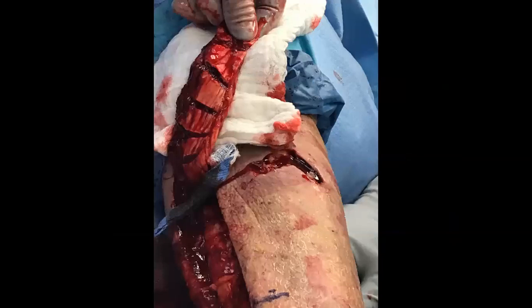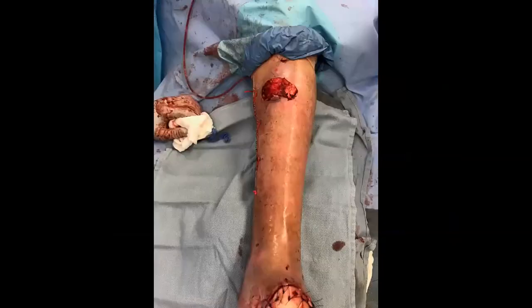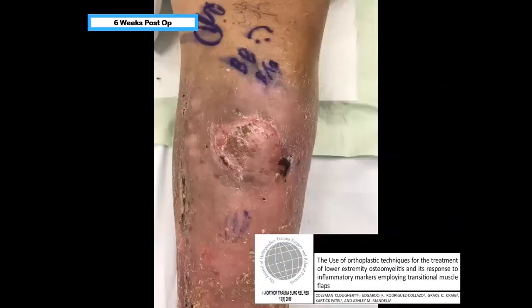On the top left-hand of your screen, you can see the gastroc muscle itself. It wasn't long enough, so those are striations that I make into the fascia to lengthen the muscle belly, to be able to cover as much area as you can. Essentially doing a couple of gastroc lengthenings on the gastroc muscle, just not for an equinus deformity. Here's the muscle tunneled under and covering the wound itself, and then about 6 weeks post-op during the skin graft.